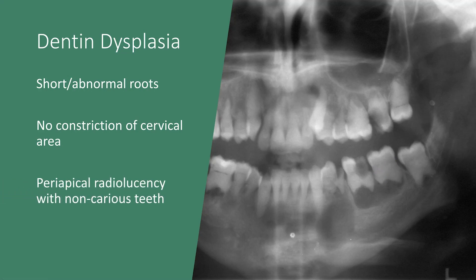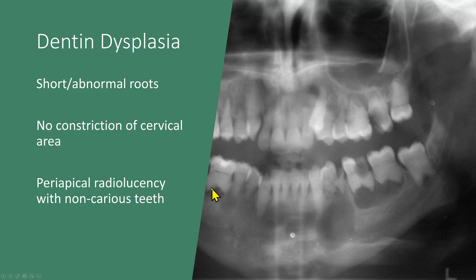One critical finding of dentin dysplasia is periapical radiolucency. There are multiple teeth with caries, but even the non-carious teeth have periapical radiolucencies. This tooth is non-carious or has a small restoration and there is a radiolucency. This tooth is non-carious and also has a radiolucency.